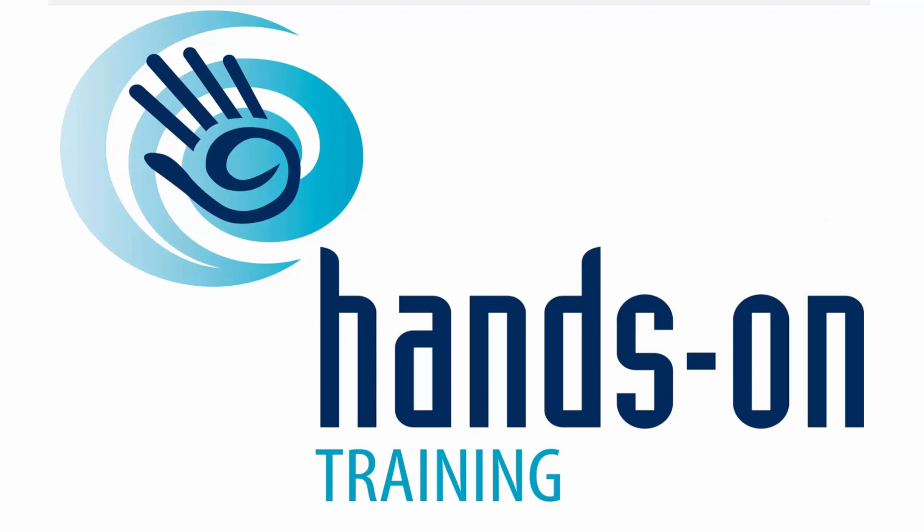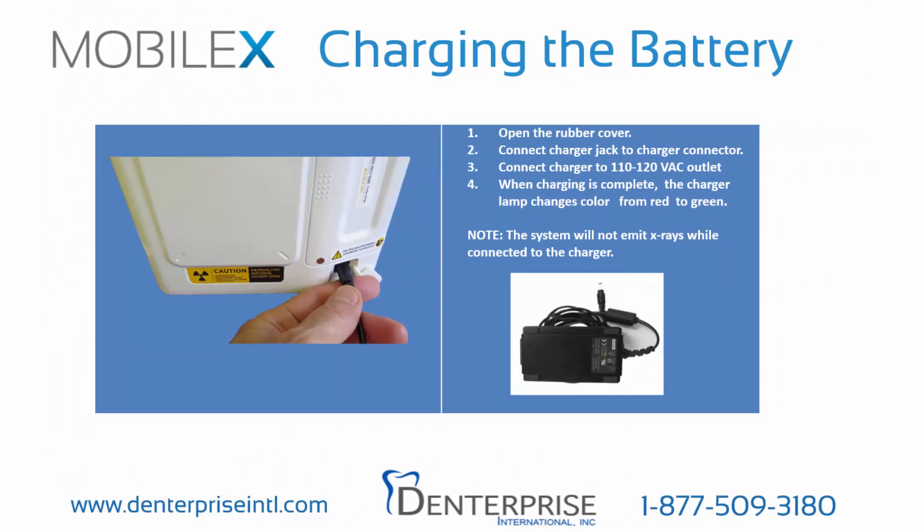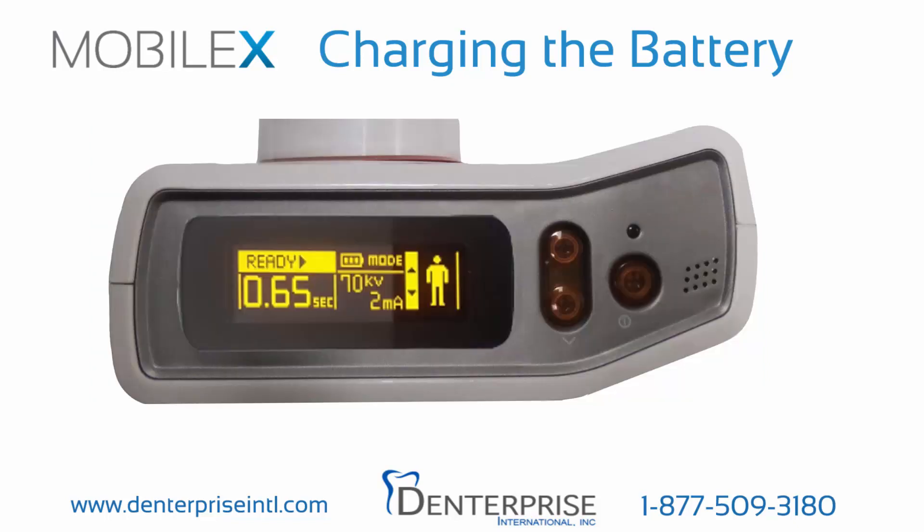First, let's charge the battery. Open the rubber cover on the back of MobileX and connect the charger jack to the system. Plug the battery charger into an electrical outlet. While the battery is charging, a red light will illuminate on the charger. Note: X-ray exposure is not available while the battery is charging. When the battery is fully charged, a green light will illuminate on the battery charger and the battery power level icon of the LCD screen on the top of the system will display three bars.